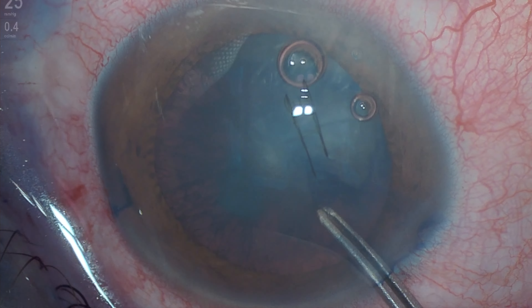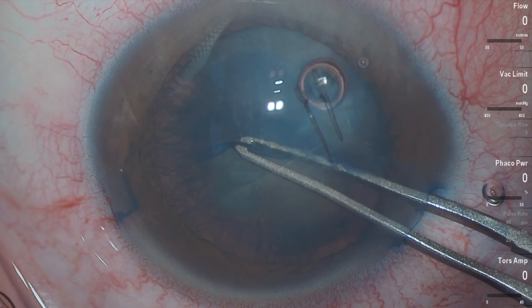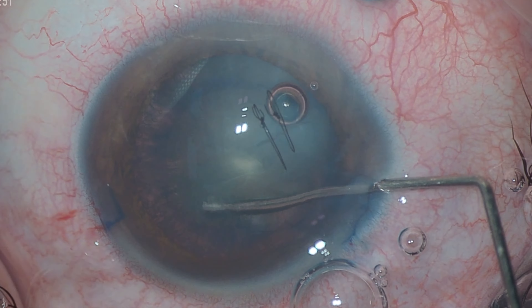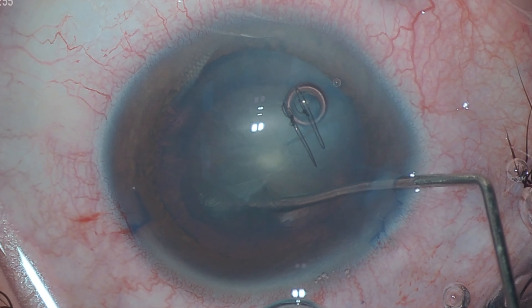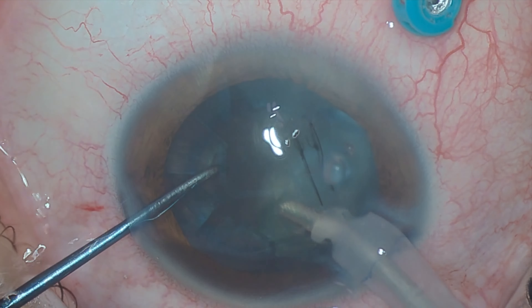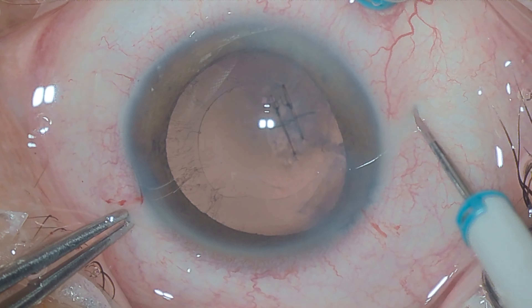Capsulorexis must be performed cautiously in these cases to ensure good support for intraocular lens implantation. After completing capsulorexis, hydrodelineation alone is performed since hydrodissection of the nucleus should be avoided due to the presence of posterior capsule rupture. Phacoemulsification of the nucleus is then carried out, followed by cortical aspiration.